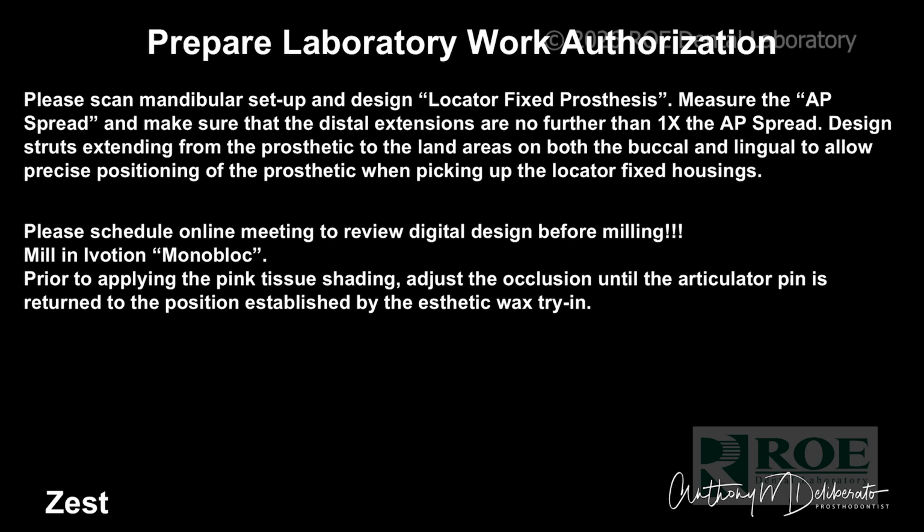He almost always says, let's do it right now. He sends me a link. We go online. He's got the case up in front. I'm saying, move this. He might see something. I think this could be, and we collaborate together to get the best design on the prosthetic.